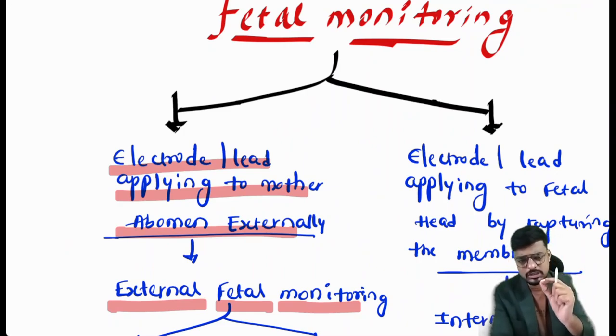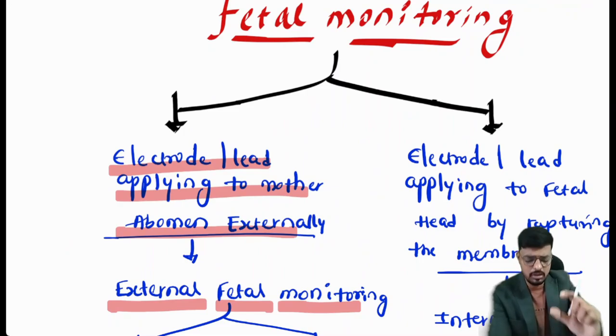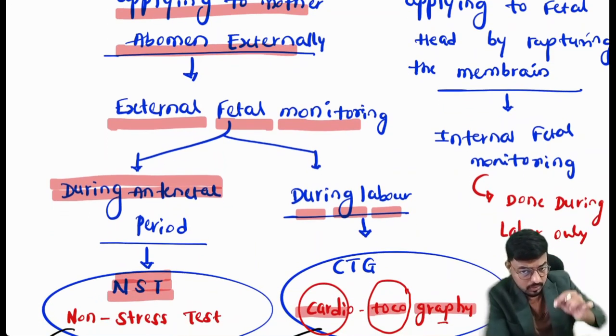It means I am doing an invasive procedure here, and the electrode or the transducer is directly applied to the fetus head. I am going inside the uterus and directly touching the fetal head. So that is the internal fetal monitoring.